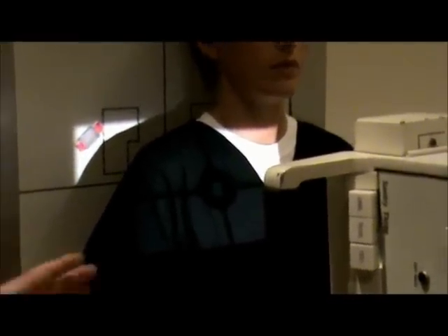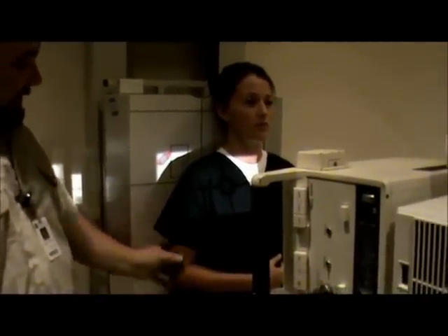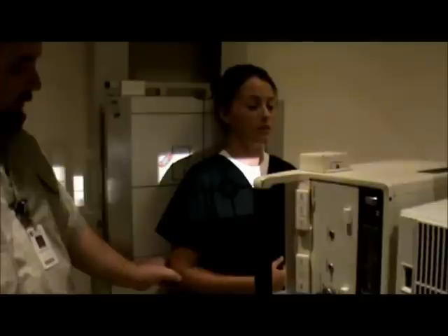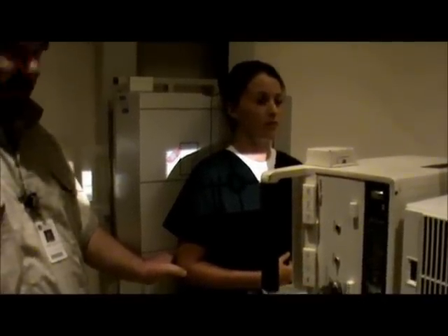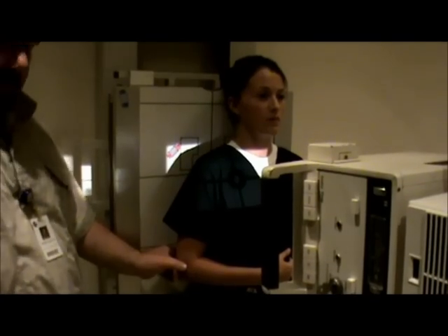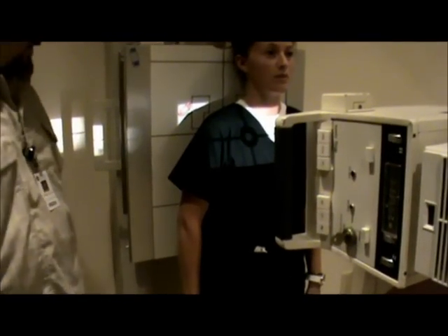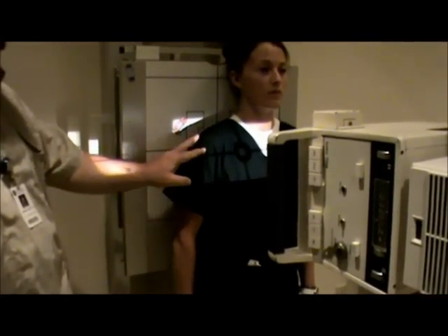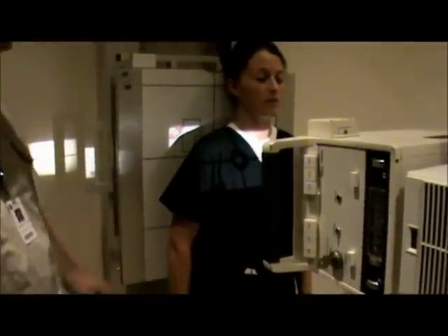Our technical factors again for this view will be 77 to 81 kV. This is the internal rotation, or lateral view. The epicondyles are going to be perpendicular to the IR. You can do it by crossing the arm, or you can do it with the arm straight down and rotating it so that the epicondyles are perpendicular. What is visualized on this view is going to be the lesser tubercle.